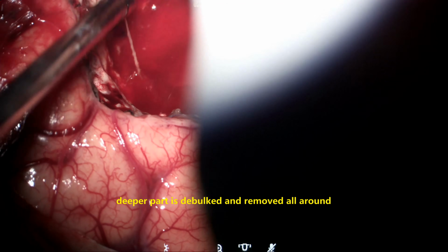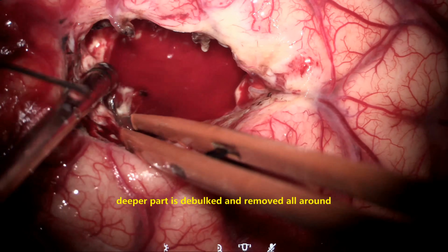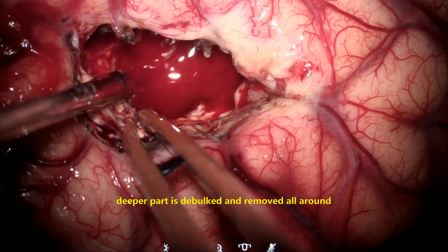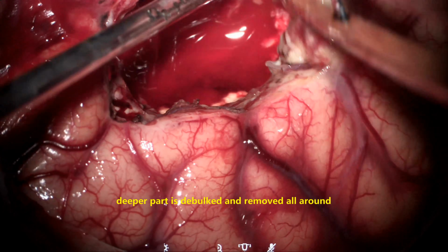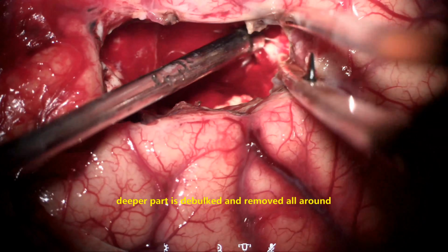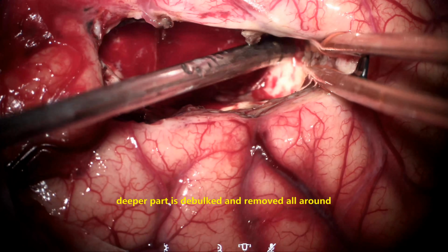We prefer always to have hemostasis at every stage so that we don't miss the tumor and normal brain boundaries, because it's very difficult as you go deeper and deeper to separate the tumor and the normal brain.